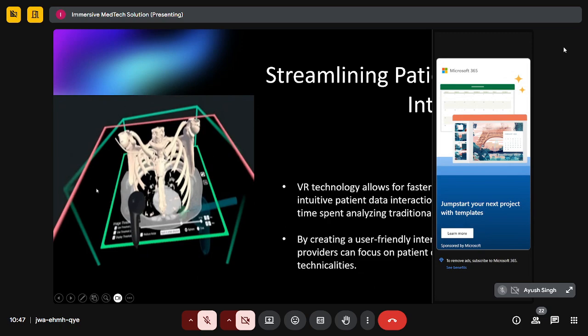So even if there's a new user, he can learn software in a short span of time. In two to three days, he can get familiar with the tools that are present in the software. And the segmentation time that usually took around 30 minutes to 1 hour using manual segmentation for complex data sets gets reduced down to 2 minutes or either 1 minute.